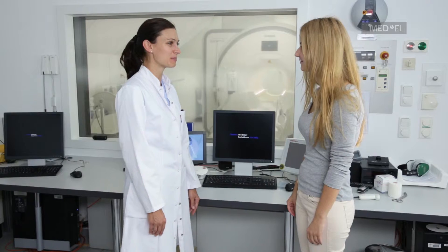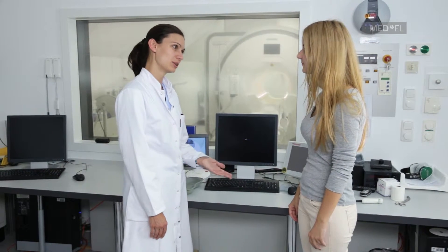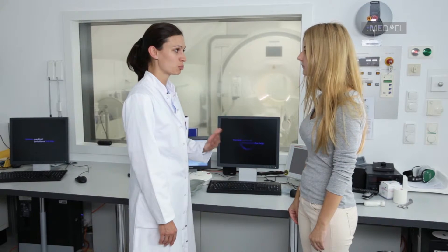To perform an MRI scan with a patient with the BoneBridge BCI-601, you'll need to follow a few basic precautions. Before entering the scanner room, inform the patient about possible auditory sensations during the examination.